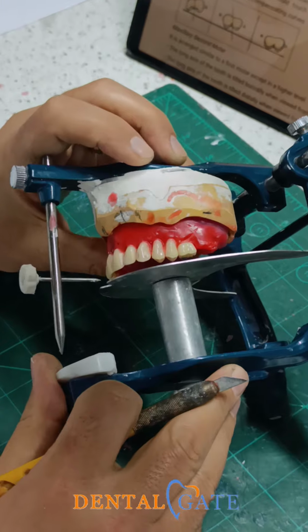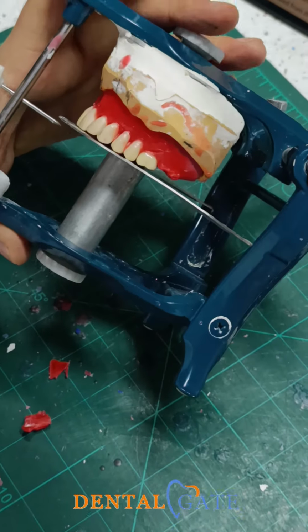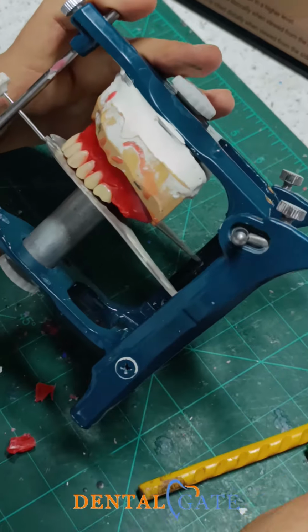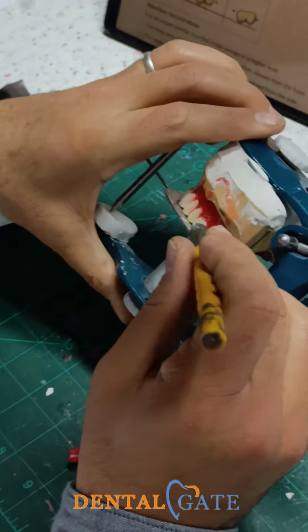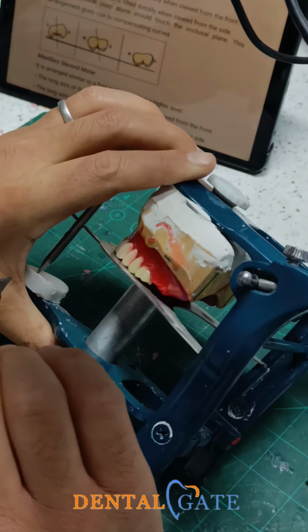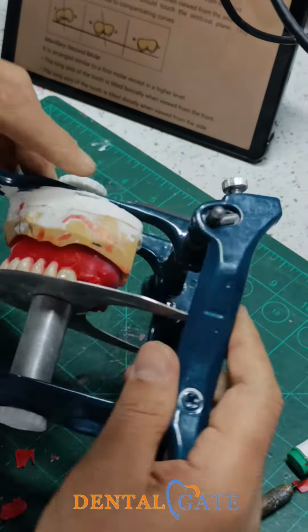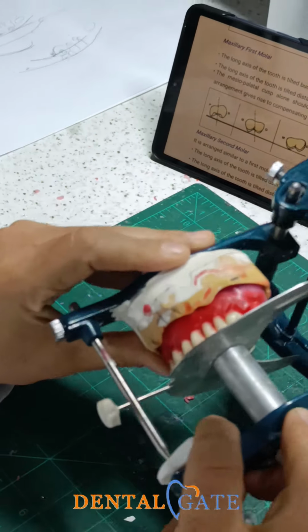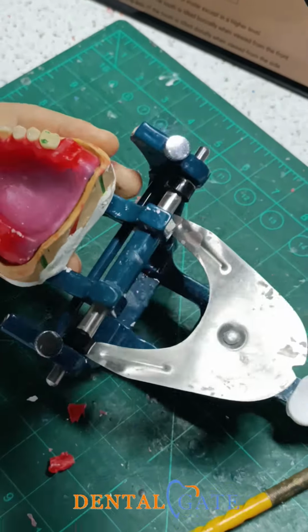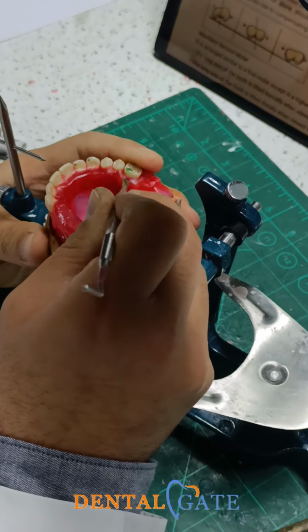So make evaluation according to the table. This is the benefit of the table. I will make these criteria within the table. So I had a severe space here. Now I can make adjustment to the molar. You can see this is the severe space. The first contact should be located within the molar.